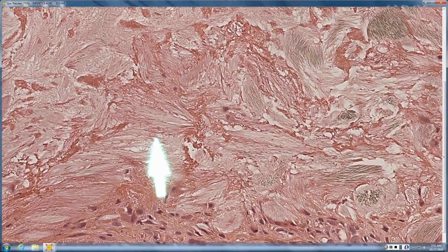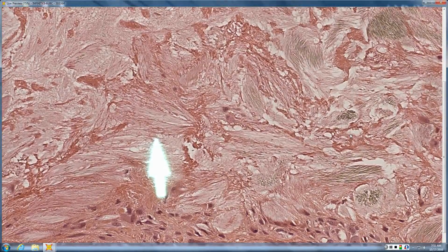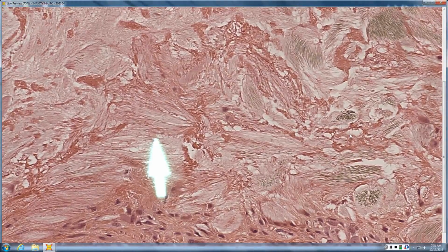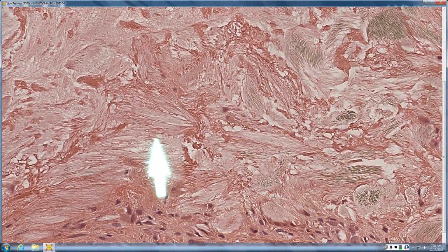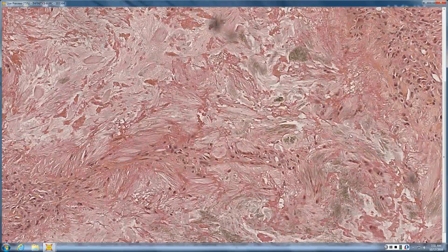I'd say the former. It was a total turnabout trip. So the four-leaf clover is what oxalosis looks like, whereas this has really feathery crystals running in groups in different directions. But you did nail it as a metabolic disorder, and gout was the first thing out of your mouth, so you get credit for that. Way to go. No chapter required.